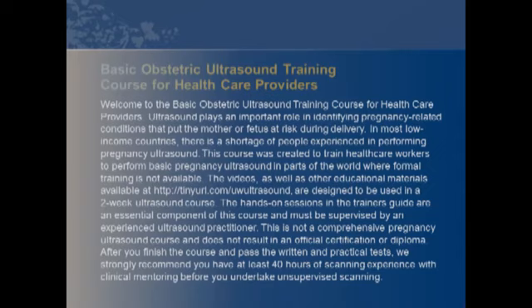Ultrasound plays an important role in identifying pregnancy-related conditions that put the mother or fetus at risk during delivery. In most low-income countries, there is a shortage of people experienced in performing pregnancy ultrasound. This course was created to train healthcare workers to perform basic pregnancy ultrasound in parts of the world where formal training is not available.